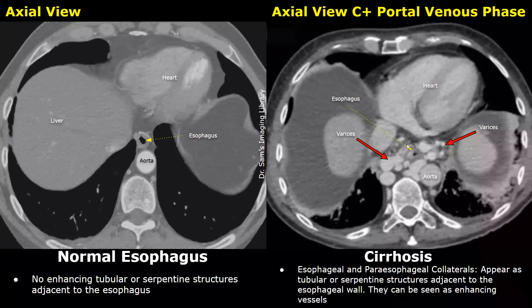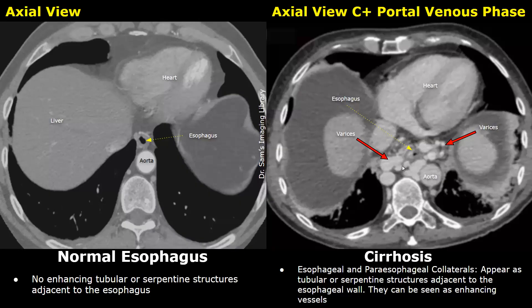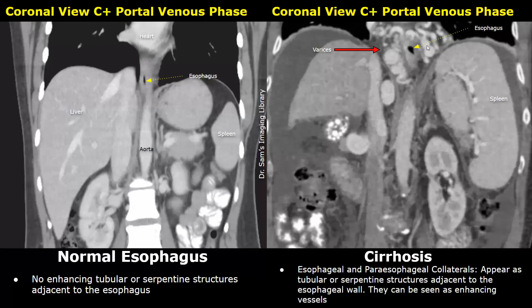Cavernous transformation is the formation of collateral vessels around the portal vein. Due to cirrhosis, many tubular enhancing serpentine collateral vessels form around the portal vein during the portal venous phase. The hilum becomes crowded with these vessels. Collateral vessels are also present near the stomach — these are called gastric varices. Collateral vessels can also form around the esophagus — these are called esophageal and paraesophageal collaterals. They appear as tubular or serpentine structures adjacent to the esophageal wall. You can see many enhancing round and tubular structures surrounding the esophagus. These collaterals are more clearly visible in the coronal plane.